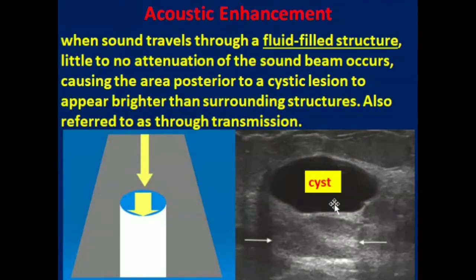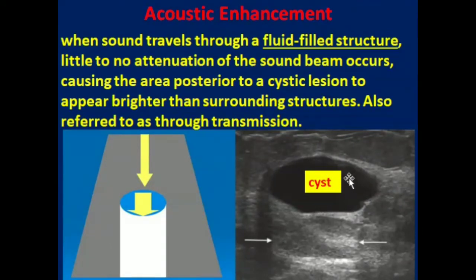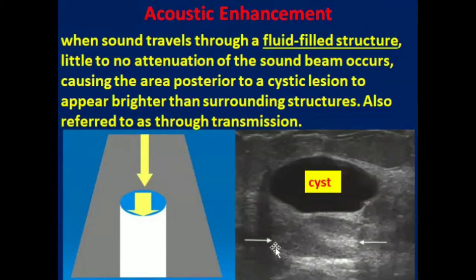This is a cystic lesion located within solid tissue. As the beam passes through this fluid-filled cyst, there is no attenuation, and whenever it hits the posterior wall there will be enhancement. In this image we can clearly appreciate the presence of posterior enhancement.